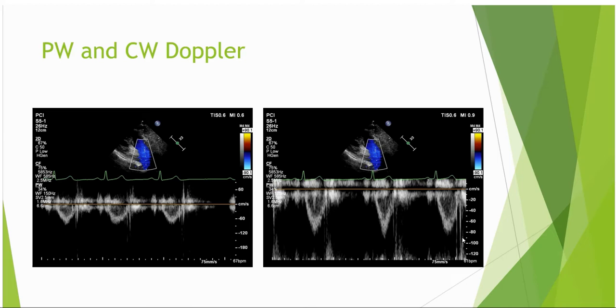Two settings sonographers often don't adjust frequently enough are scale and sweep speed. Many times the eye gets used to seeing regular patterns and we may not recognise that something could be improved upon. Scale affects the vertical height that the flow profile occupies in the available space. Basically, we want to maximise this space so we can get the best visual representation and have the least margin of error with caliper placement and VTI traces.